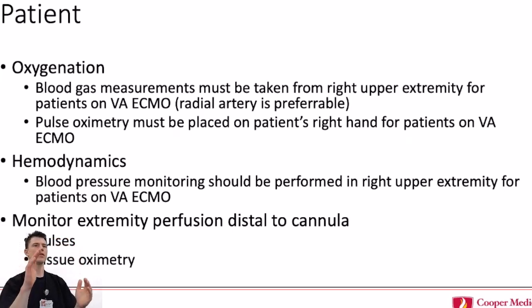If you have lungs that aren't working well, then the blood that's coming out of your native heart may not have very good oxygenation, versus the blood that's coming from ECMO, which has very good oxygenation. So where those two things meet, it may be beyond the blood vessels that are going to our brain and where we're perfusing our coronaries.